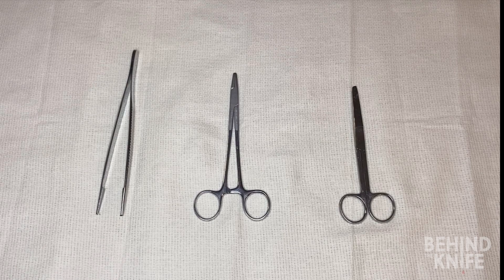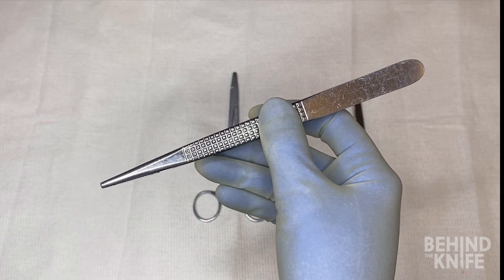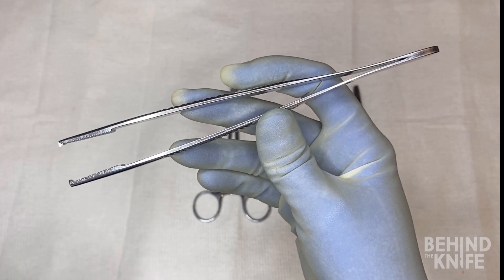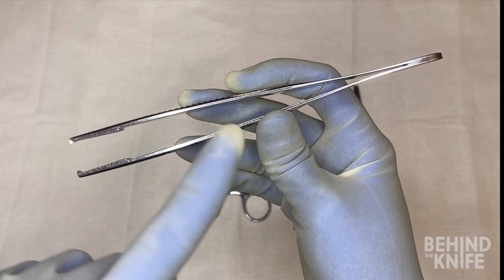The first instrument we're going to start with is the forceps. The best way to use this is to hold it like a pencil in your hand. You generally don't want to be too close or too far away from the tip of the instrument — somewhere in the middle is often best.